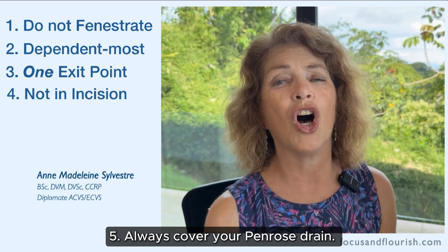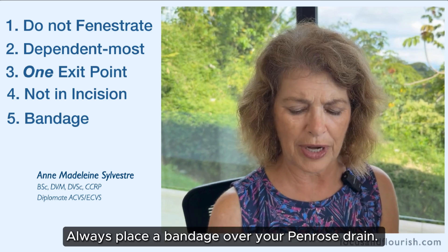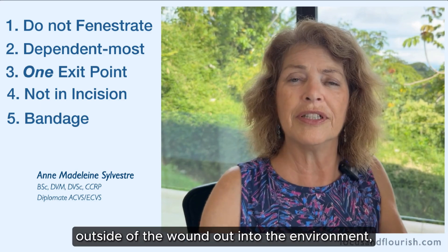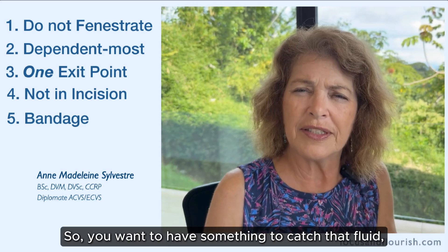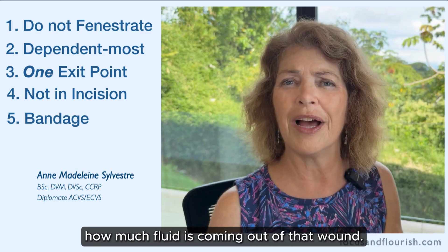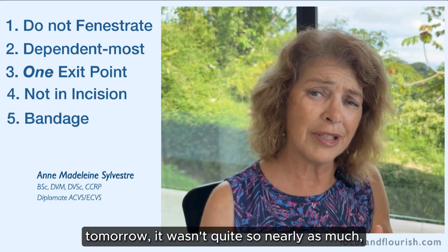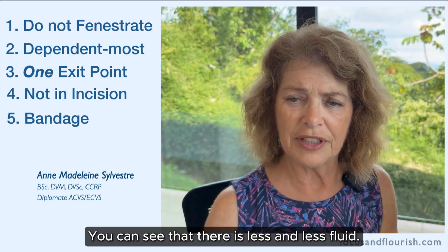Five: always cover your Penrose drain — always place a bandage over it. The most important reason is that the Penrose will bring all the fluid outside of the wound into the environment and make a mess everywhere, so you want something to catch that fluid. You also want to be able to monitor how much fluid is coming out: if today the bandage was soaked but tomorrow it wasn't nearly as much, you know there's a progression with less and less fluid. Bandaging is important.